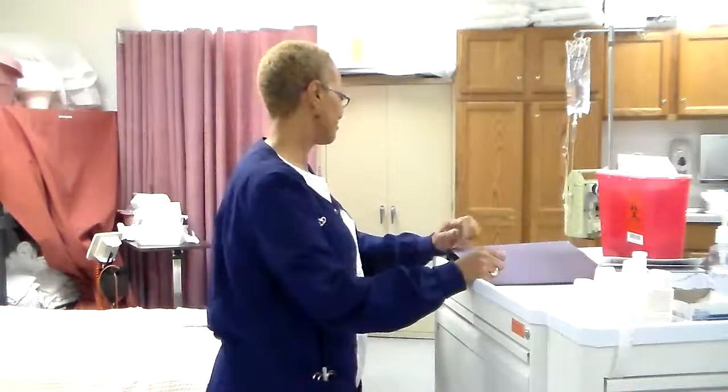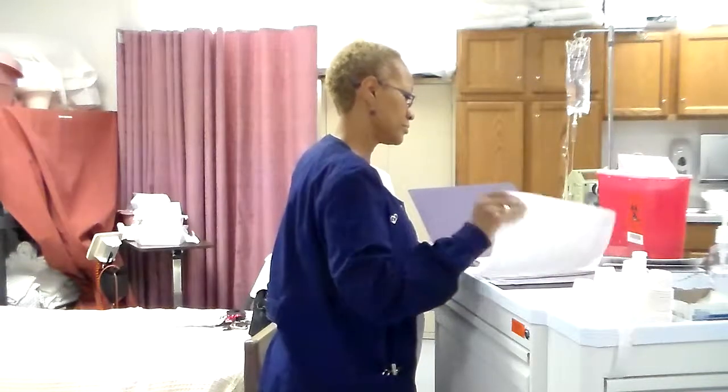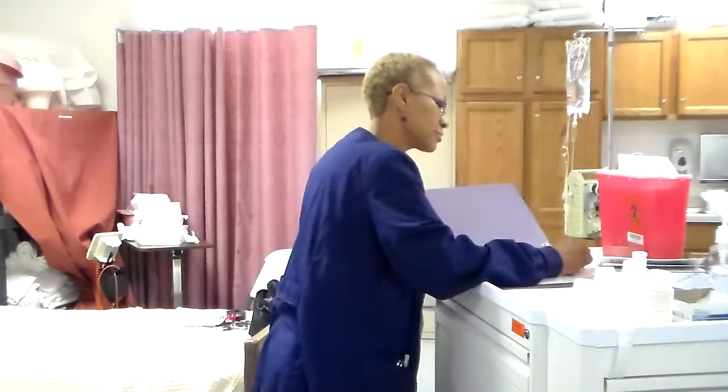Record volume of fluid in medication bag or Volutrol on intake and output form. Report any adverse reactions to client's healthcare provider.